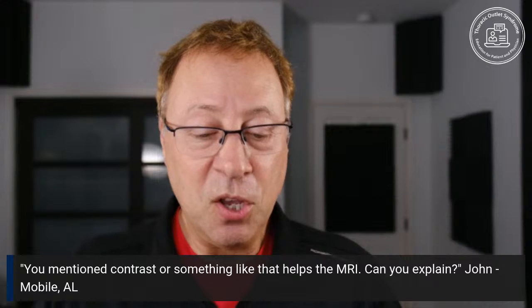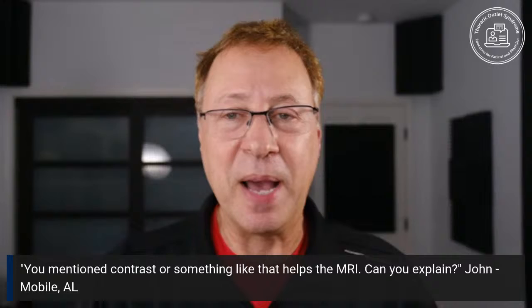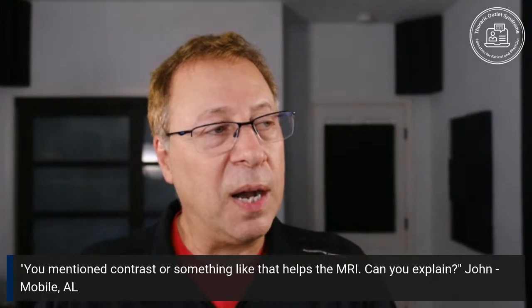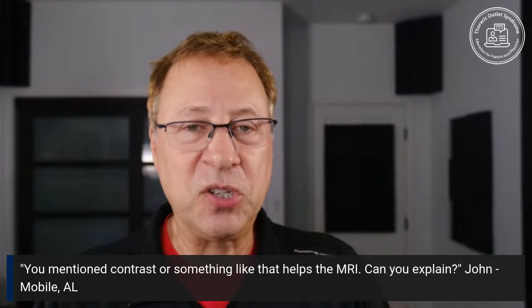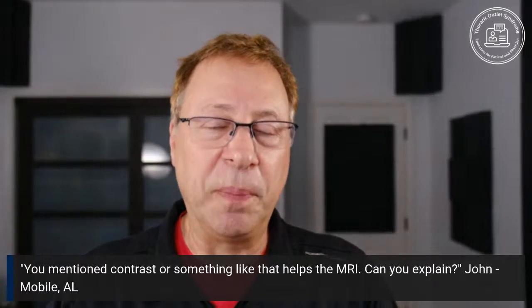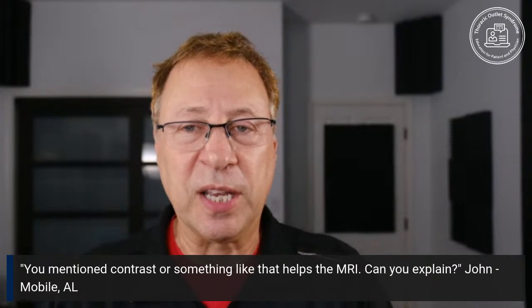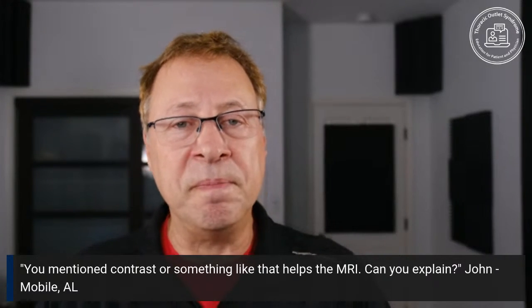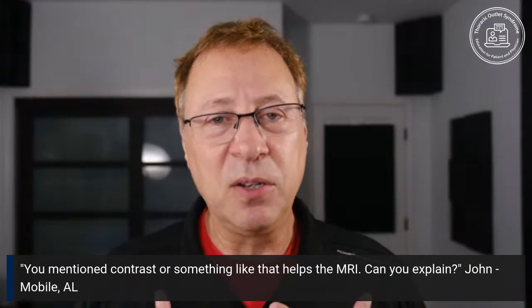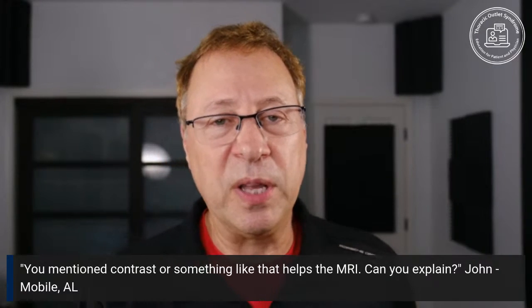All righty. You mentioned contrast or something like that helps the MRI. Can you explain? And that's John in Alabama. Thank you, John. So we give contrast on almost all of our MRIs. We do it for a number of technical reasons that help certain things stand out, but in particular, to get the MR angiogram pictures that you saw, those beautiful pictures that show just the white arteries, we need the contrast to get the best quality images. And then we can also get pictures of the veins when that contrast flows through the arms and comes back towards the heart. So we can get angiograms and venograms. And I think that's the most important reason that we do give the contrast.